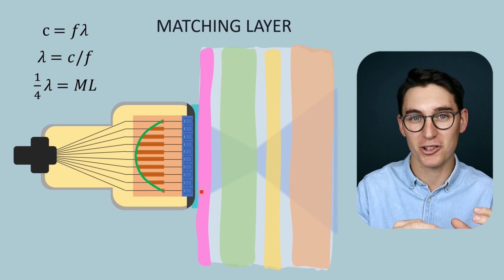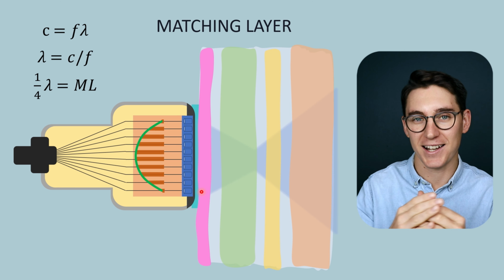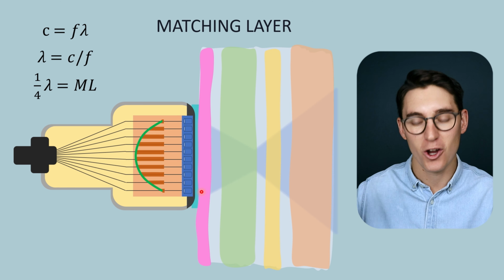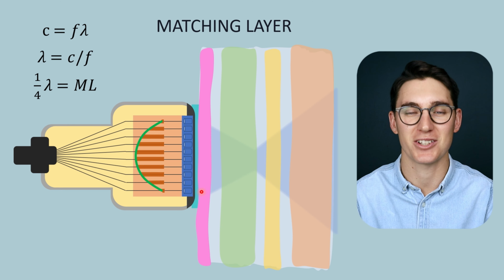So join me there, where we will look at how exactly that damping layer shortens our spatial pulse length and allows us to have those long receive times, waiting for those echoes to return back in order to create our ultrasound image.